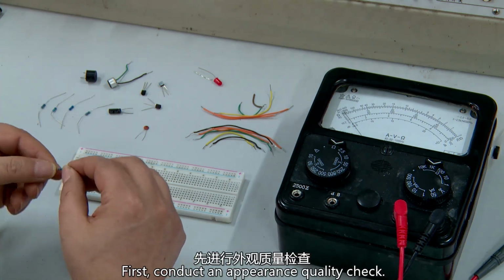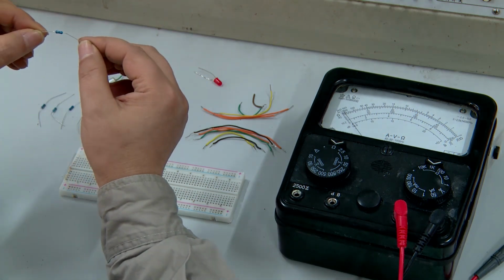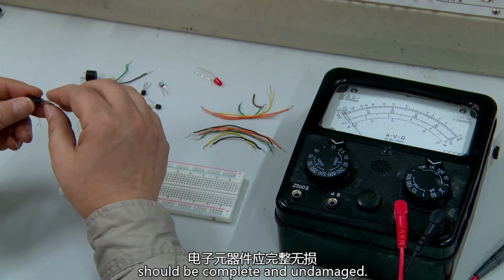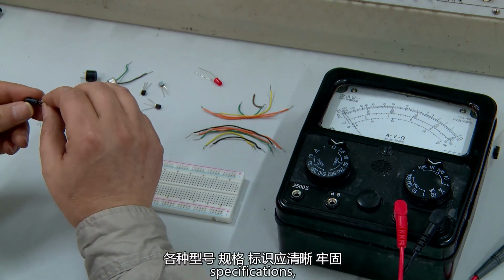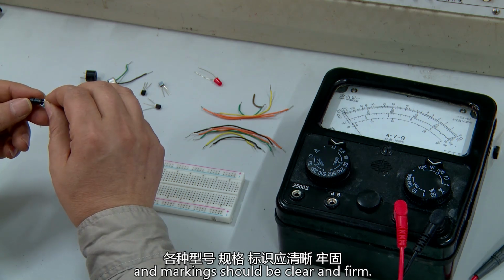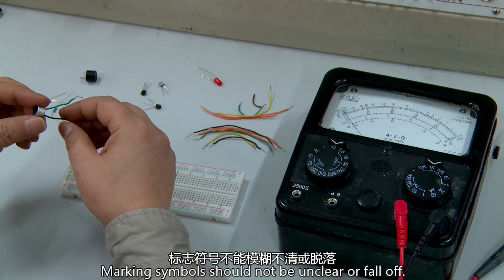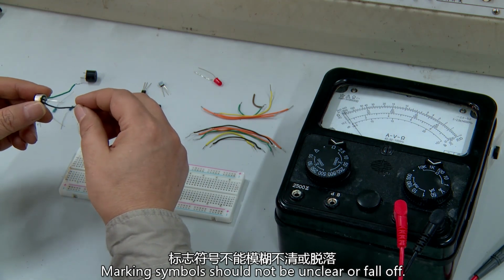First, conduct an appearance quality check. Electronic components should be complete and undamaged. All models, specifications, and markings should be clear and firm. Marking symbols should not be unclear or fall off.